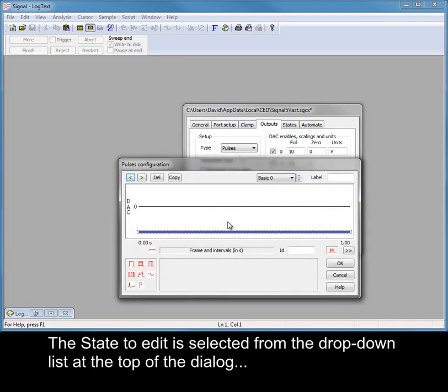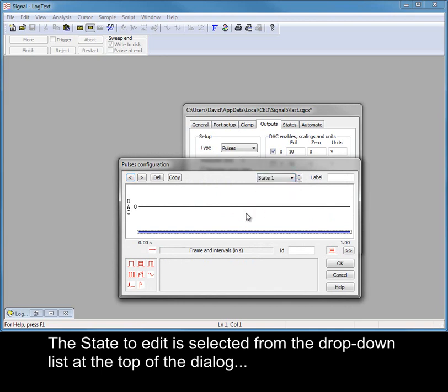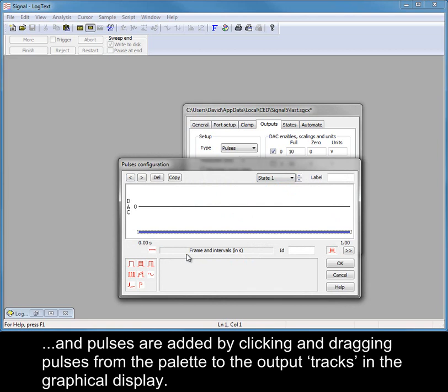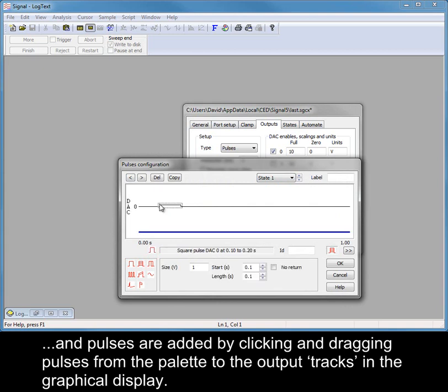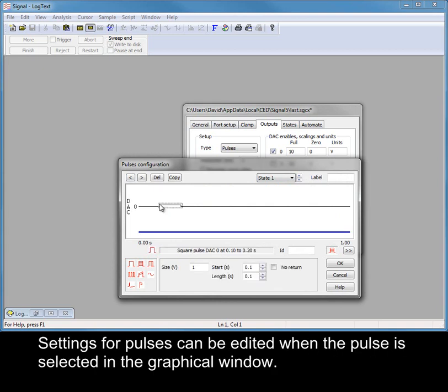The state to edit is selected from the drop-down list at the top of the dialog. Pulses are added by clicking and dragging pulses from the palette to the output tracks in the graphical display. Settings for pulses can be edited when the pulse is selected in the graphical window.